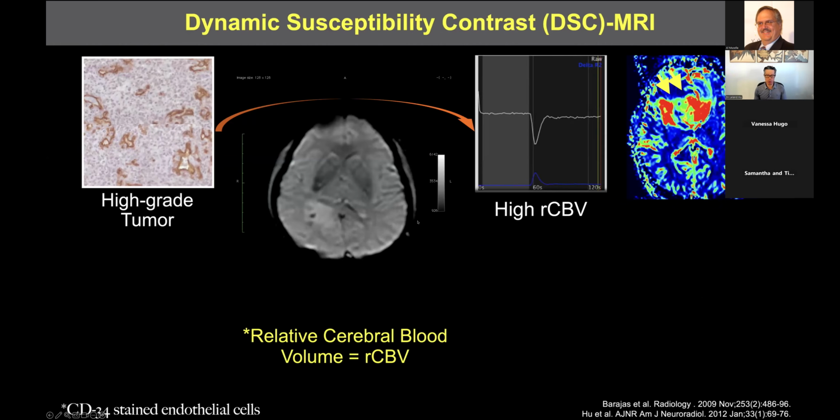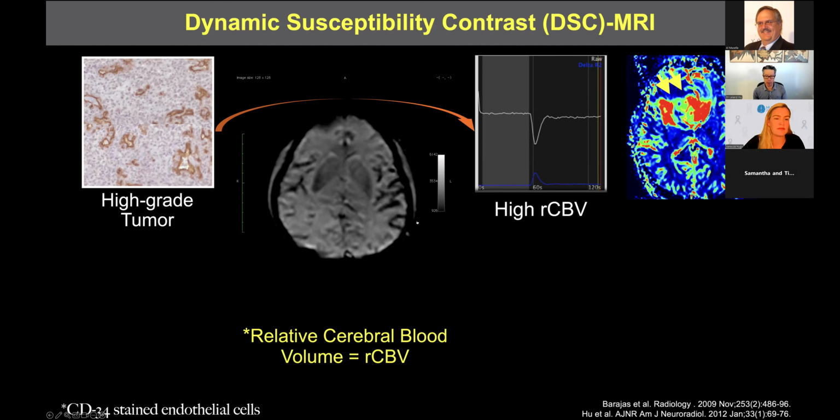So this has really motivated us in the imaging world to pursue other advanced MR techniques to provide a complement to conventional MRI. It's not to say that we're trying to replace conventional MRI, but we can help with sequences and imaging techniques to improve that diagnostic accuracy and specificity. And so this has motivated a lot of us in the field.